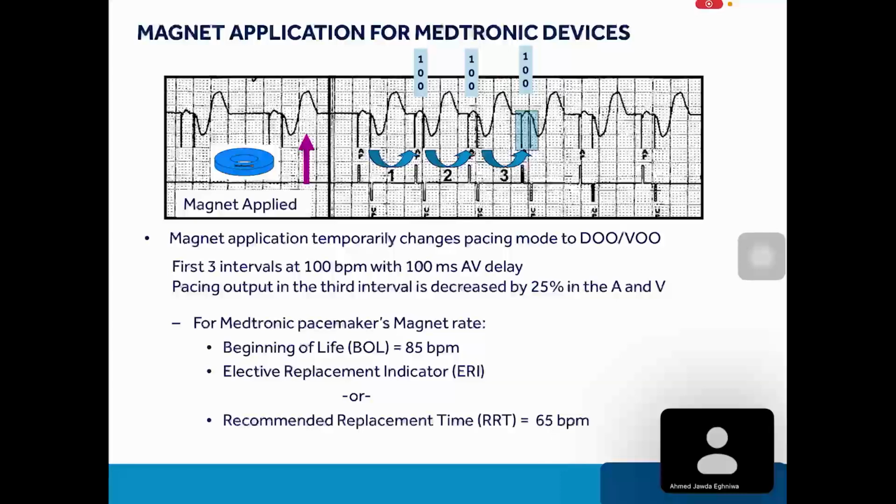My question, doctor, if I put the magnet on the patient and the patient feels dizziness or near syncope, this means the battery is at end of life, yes? No, no, no, no. You will depend on the rate. Yes, depend on the rate, provided the lead is good and the post lead are good.